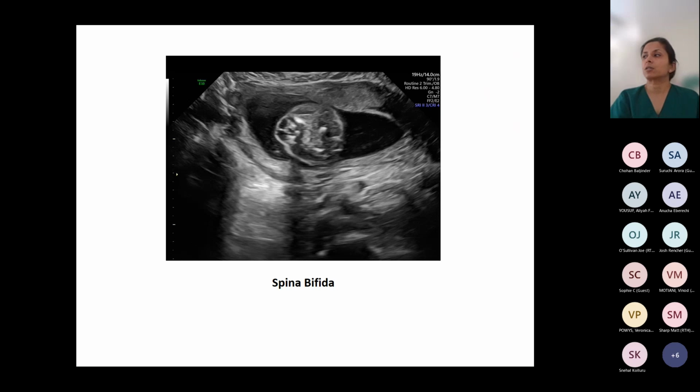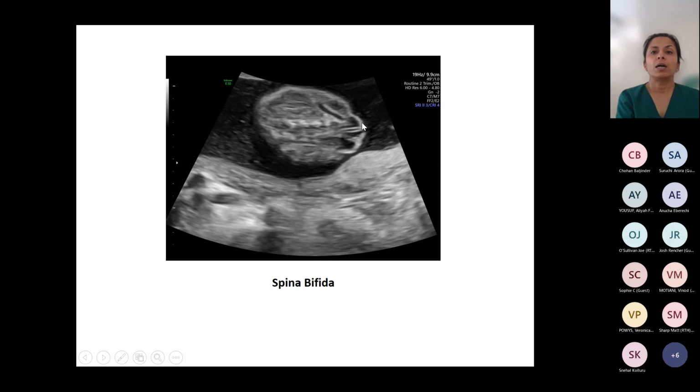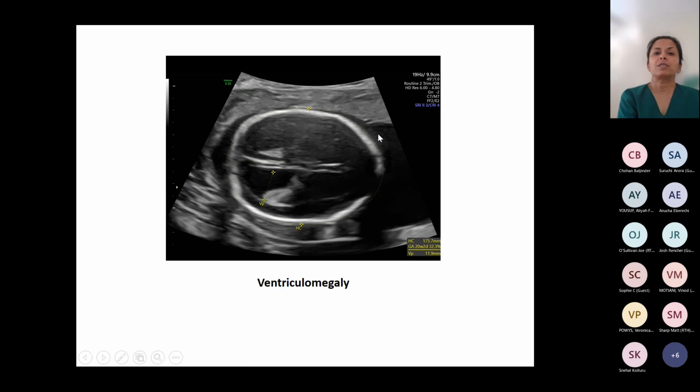This is spina bifida. If you look at my arrow here, that's a cross-section of the baby's pelvis region. And just over there, you can see that's an open neural tube defect. And there's a slightly coronal section here. There's a spine, and just over there, you can see this open defect. And this is the head or brain of this baby whose spine we saw.